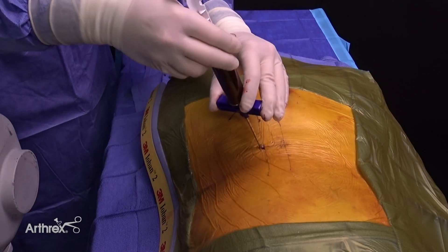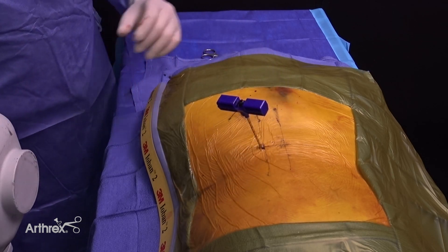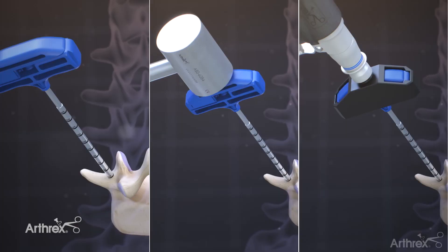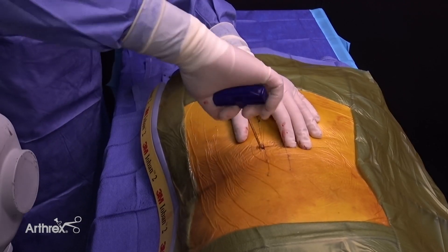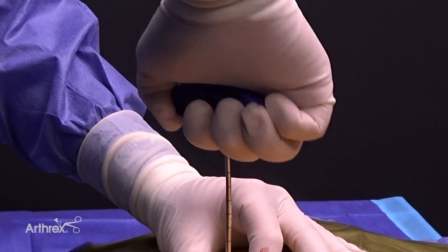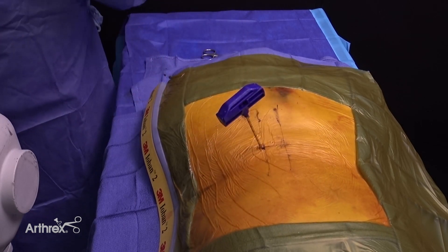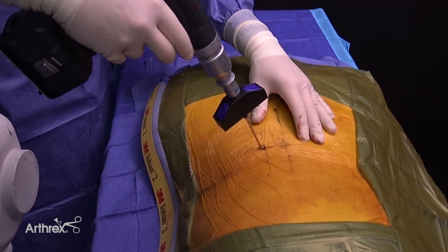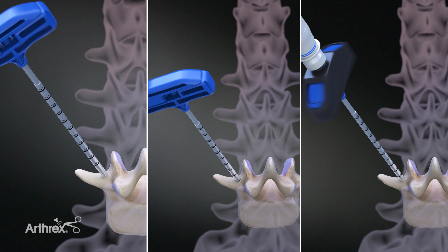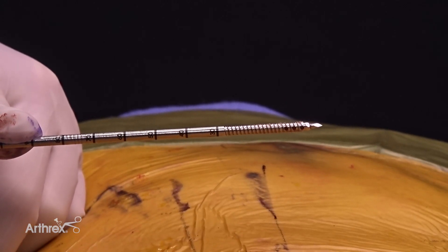When the desired amount of bone marrow has been aspirated, unscrew the syringe from the needle, making sure to hold the handle with your opposite hand to keep it from turning. After the syringe is removed, replace the stylet into the needle, making sure that it locks into place. Removal of the needle can be accomplished three ways: unscrew by hand turning the needle counter-clockwise until it comes out of the bone; pull the needle out by grasping the handle firmly with one hand and moving it in a back-and-forth motion until the needle pulls straight out; or by powered removal using the power adapter on a battery-powered drill and running the drill in reverse. It is also acceptable to use any of these three methods in combination with each other. After removal of the needle, always check the tip to make sure that all threads are present.